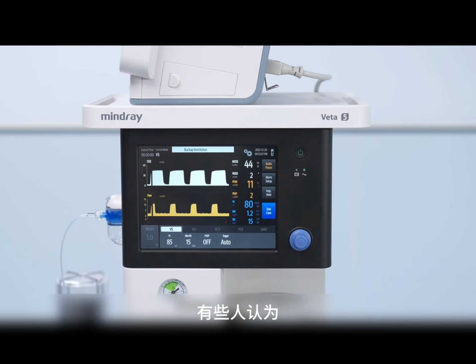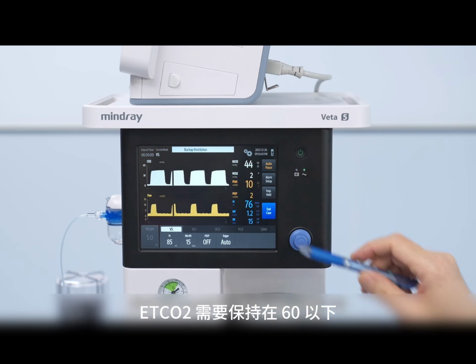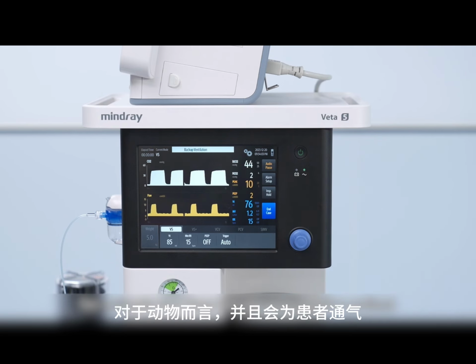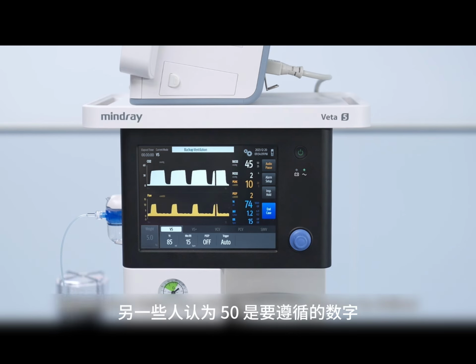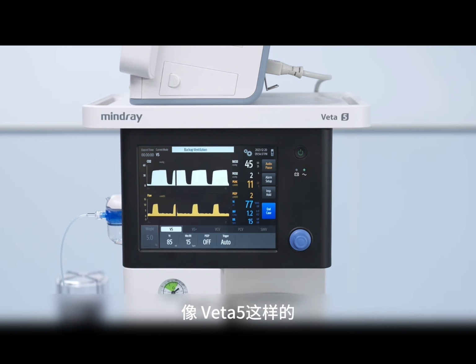Some people think animals' end-tidal CO2 needs to be kept under 60, and they would ventilate the patient when it's higher than that. Some others think that 50 is the magic number to follow. I would rather think that if you have a high-end ventilator such as the Veta 5, I would make a reasonable effort to keep this value within the reference range.